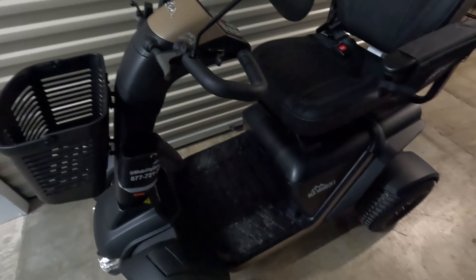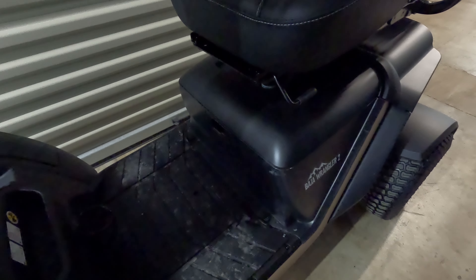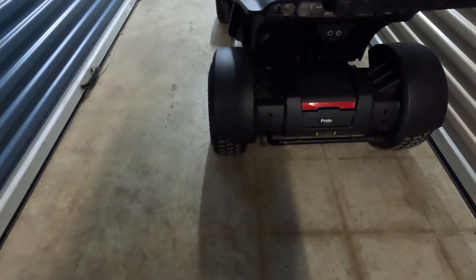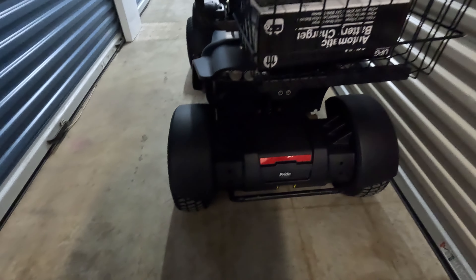My particular unit came with the batteries pre-installed. I did have to set the breaker here because there was no power. In the video, they just reached back and gently grabbed the little bar and lifted out — yeah, that was not my experience. I was expecting the batteries to be in one of the other boxes, but no, they were pre-installed. He's way stronger than I would be — no, his batteries just weren't installed.